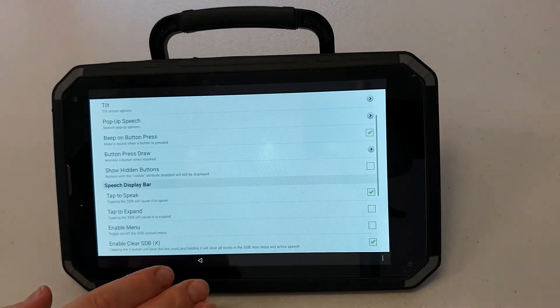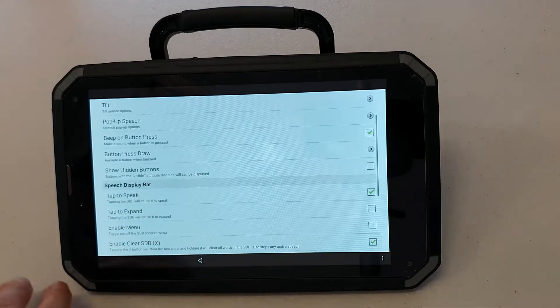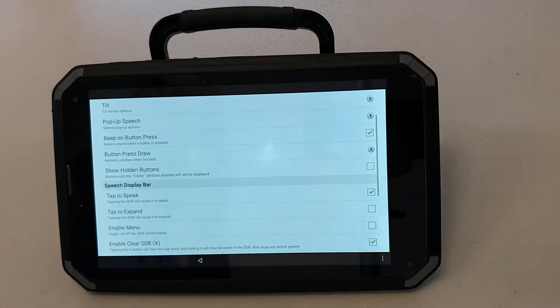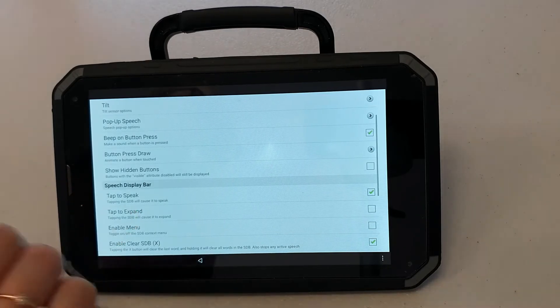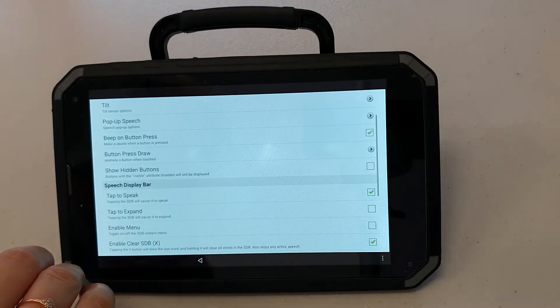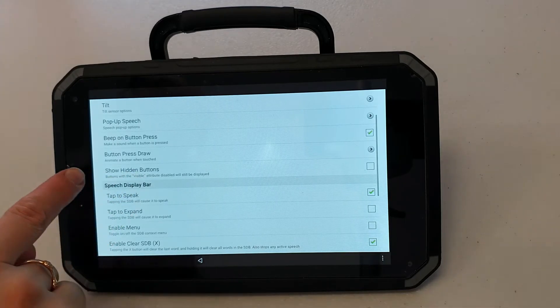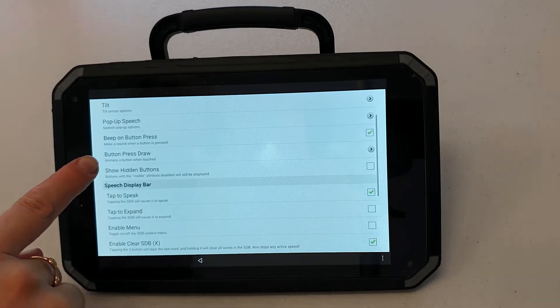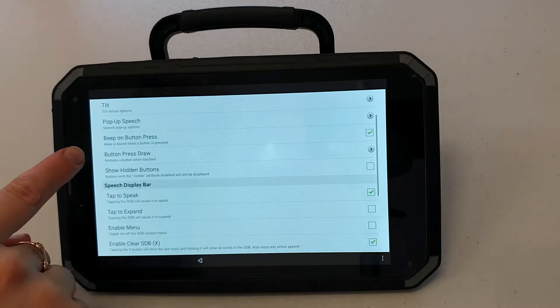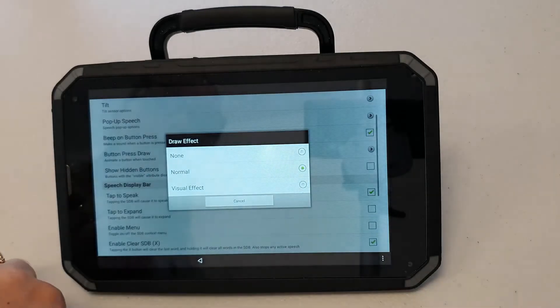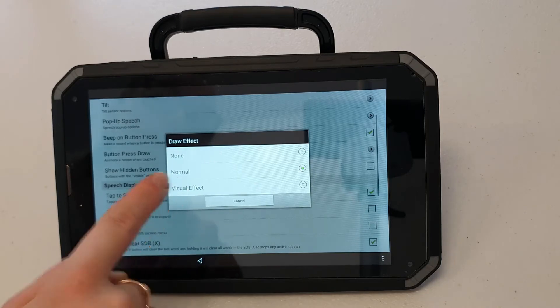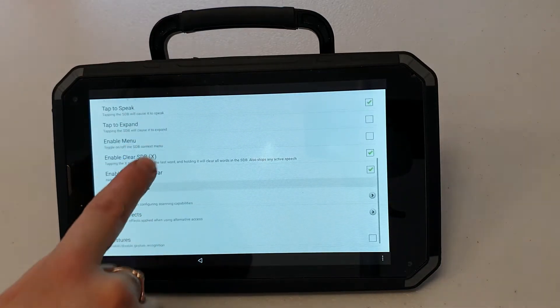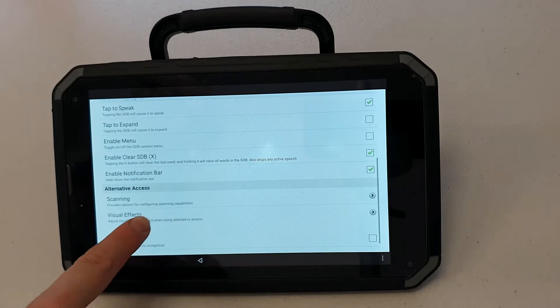I might also want to have increased visual feedback when I press a button. For example a button might turn bright red and be magnified when I press it. This is helpful for some users. To get this setting working I'm going to press button press draw and select visual effect. When I scroll down I can see that I now have the visual effects menu.